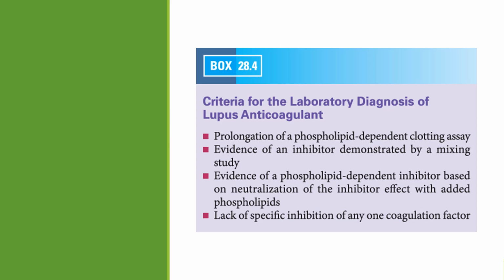So again, our factor assay dilutions, we're going to see an increased activity with increased dilution, so neutralization of the inhibitor. And then lack of specific inhibition of any one coagulation factor. So we're going to see inhibition with many factors, not just one specific factor.